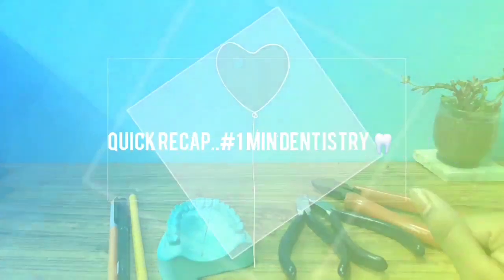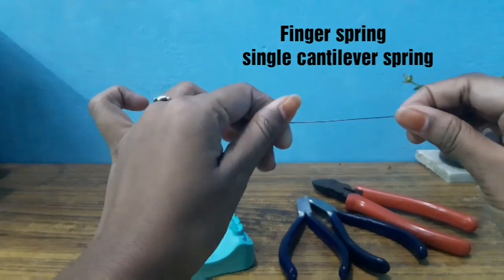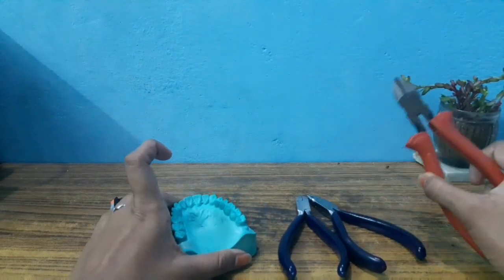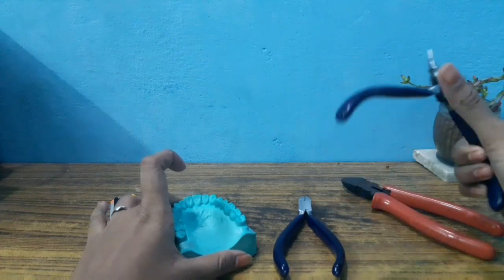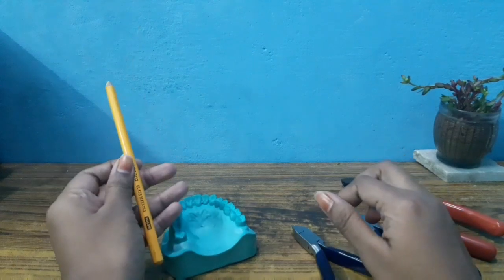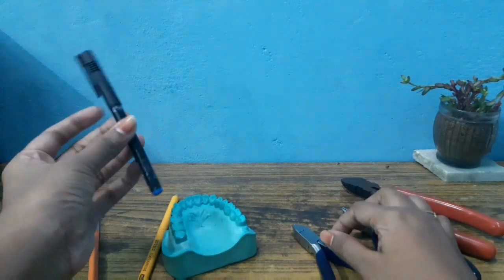Hi friends, in this video, how do you make a fingerspring? We have 23-gauge wire, ideal cast, cutter, universal plier, Adam's plier, and a glass marking pencil or you can use a normal marker pen.